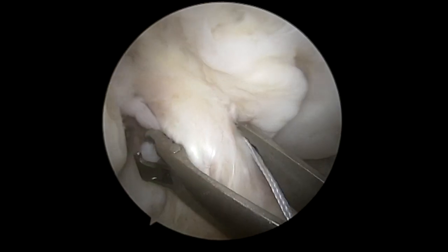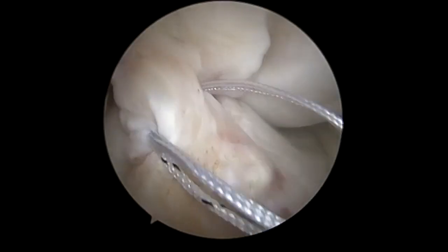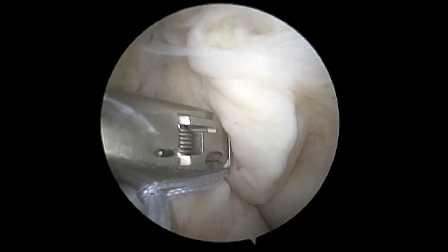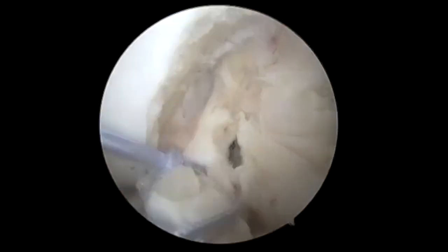Here we're going to use the fiber rings — these are 35 millimeter fiber rings. We're going to do one from the medial side to get the anterior medial bundle, and then one from the lateral side. This helps with suture management and with passing in different orientations.